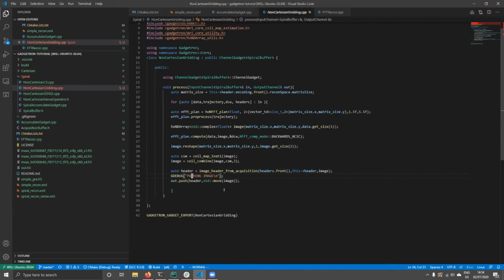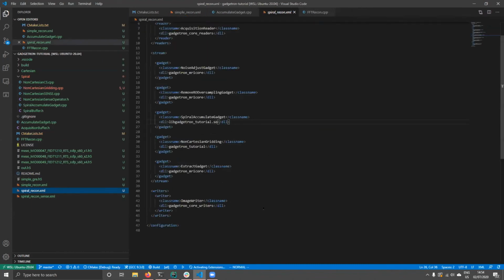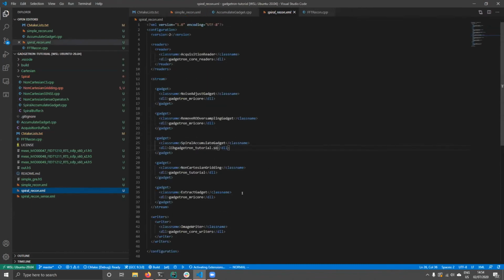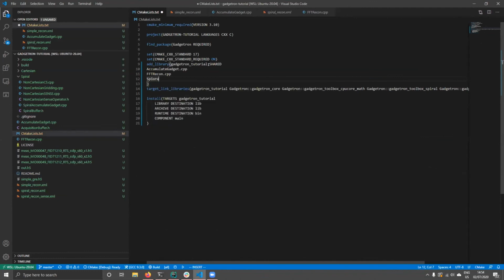And we push the image along. So if we look at the spiral recon here, you can see we have the accumulate gadget, the non-Cartesian gridding, and extract. So let us run that. We need to add it. Spiral.